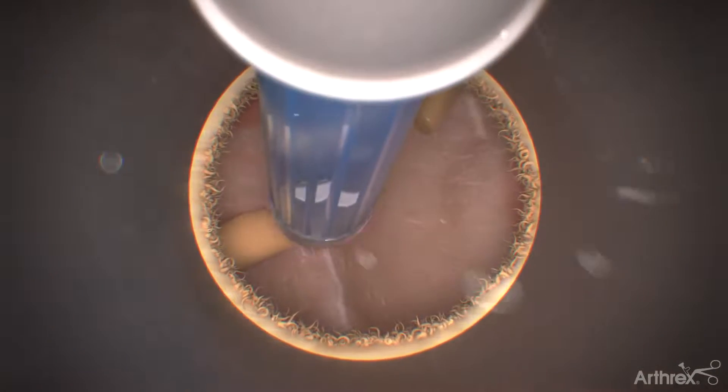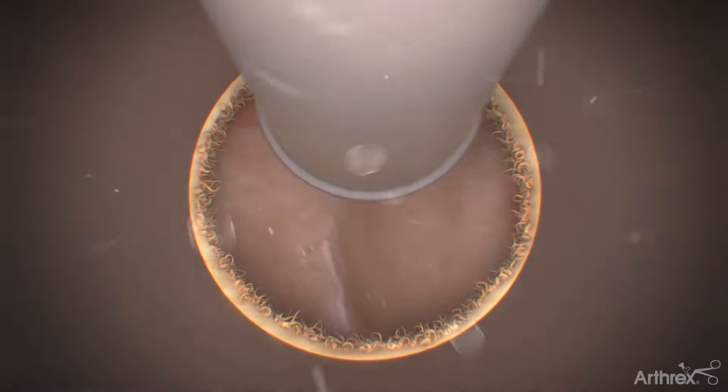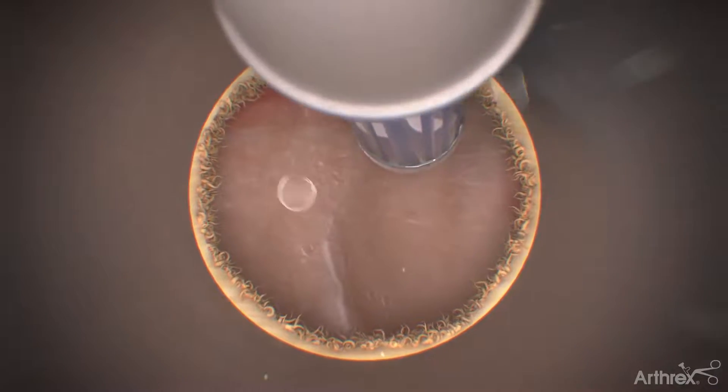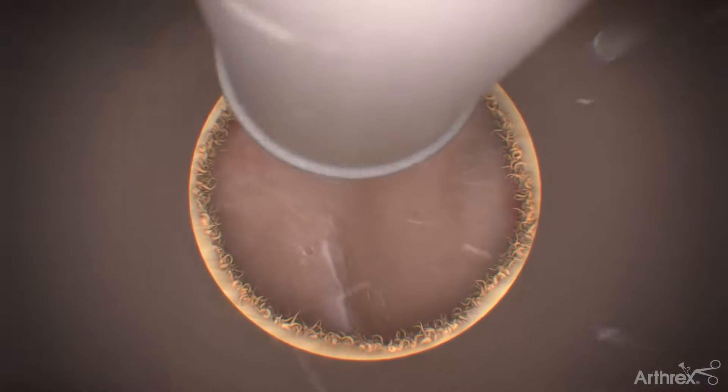Use the electrosurgical probe to treat the excised nerve endings and debride the surface of the bony anatomy continuing up towards the facet.